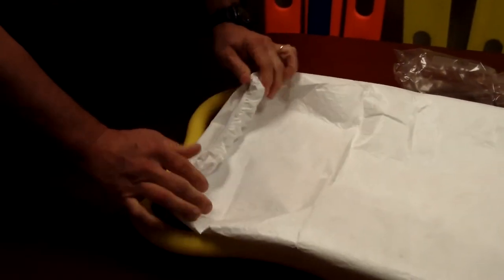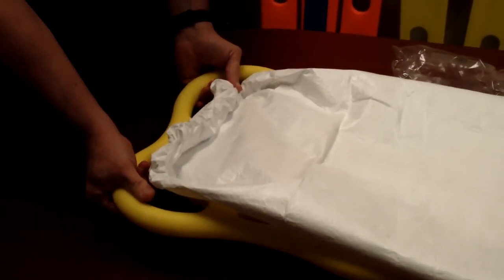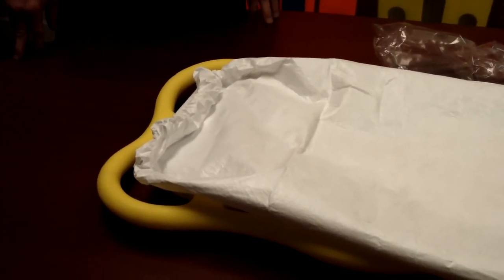Once the patient's on, you can actually wrap this around the patient's feet, which works out great, and then you can just pick up the patient like this. That is the in-service of the Board Armor backboard cover.